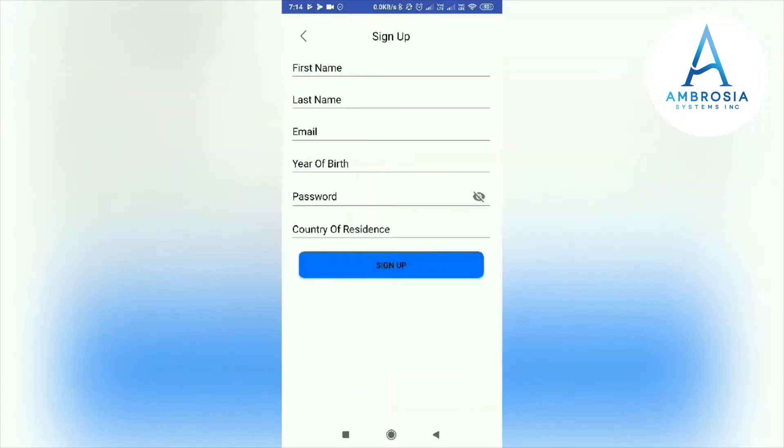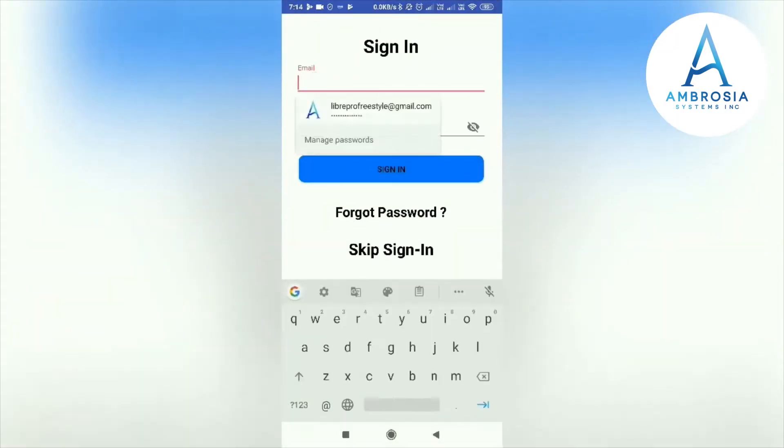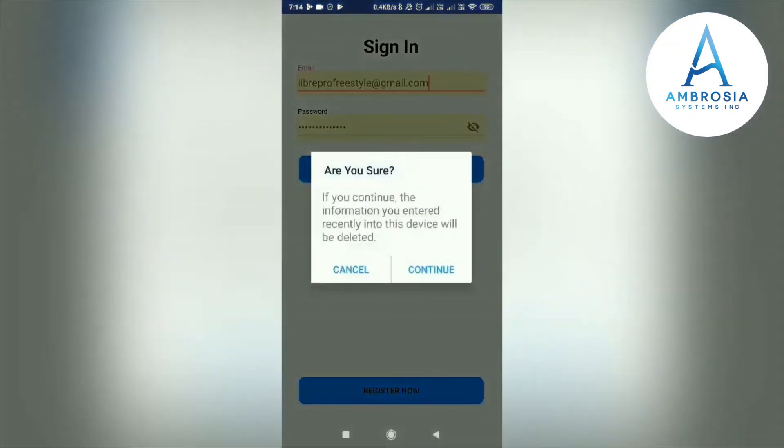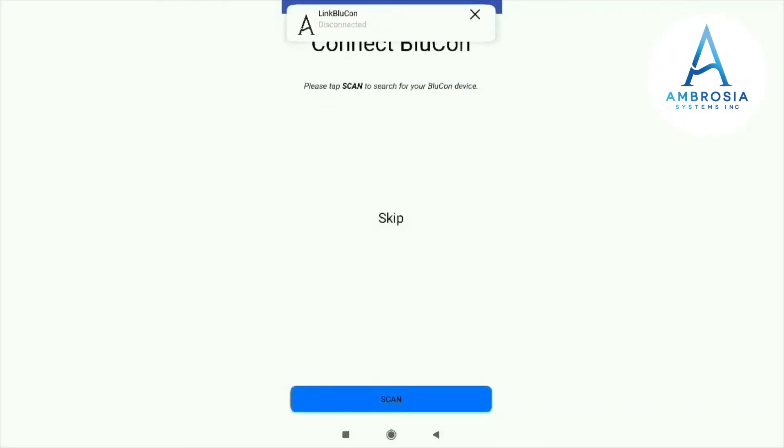You can use the sign-up form to sign up to the LinkBlueCon app. I have already signed up, so I'm putting in my login details. We don't have any data on this device, so clicking Continue. We are successfully signed in now.